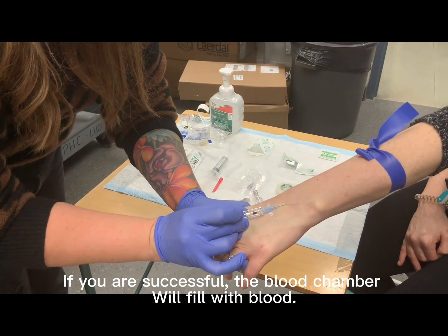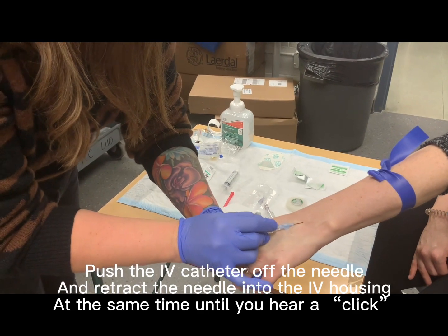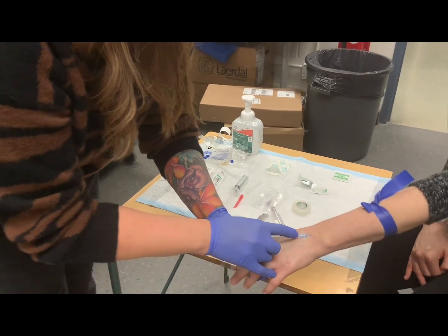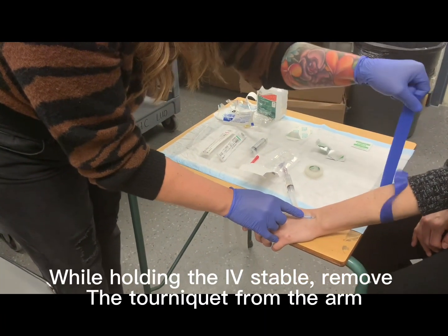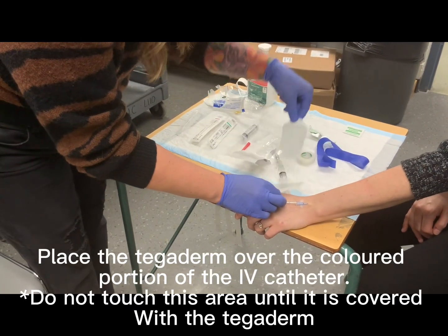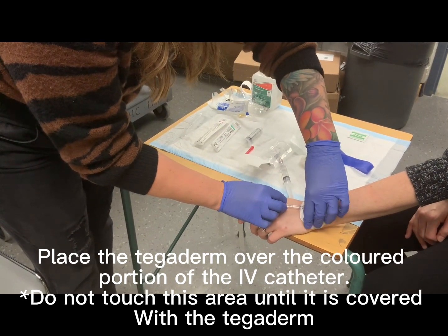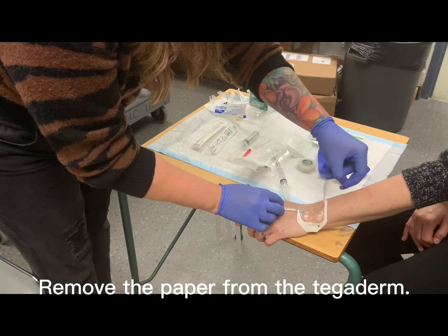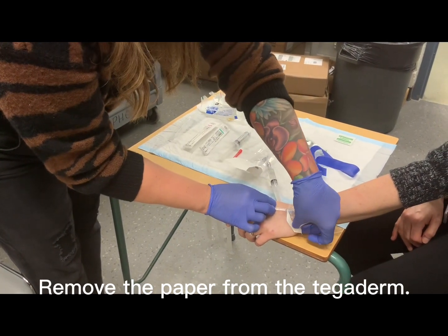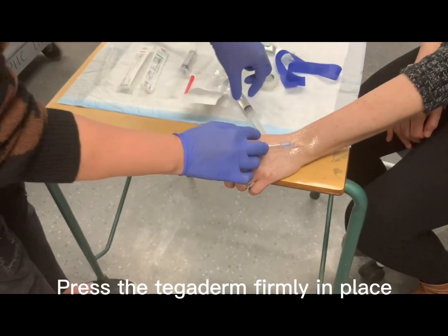Pause to watch the blood fill the blood chamber. Once it has filled, move the catheter off the IV and the IV needle back into the housing until you hear a click. Remove the tourniquet. While maintaining stability of the IV, remove the paper component of the tegaderm and place the tegaderm over the colored portion of the IV catheter. Remove the paper off the tegaderm. Then press the tegaderm firmly down in place.